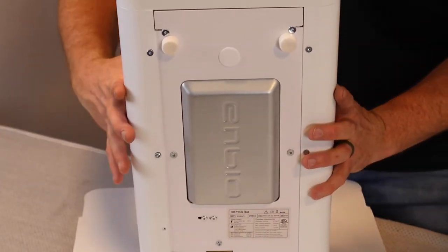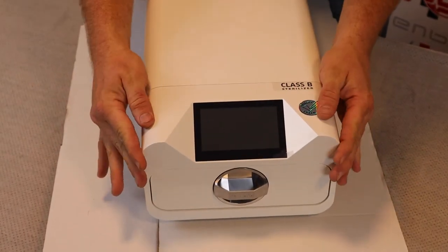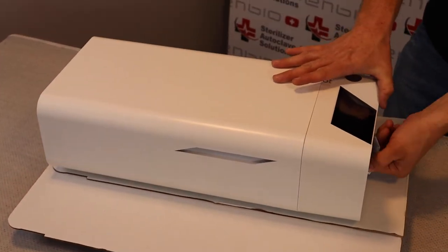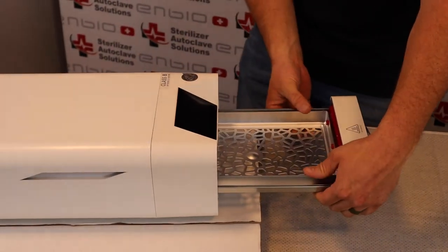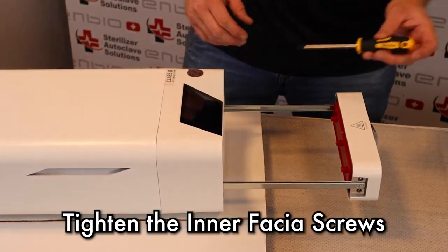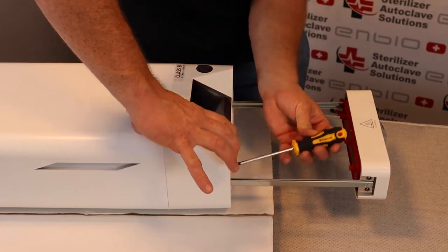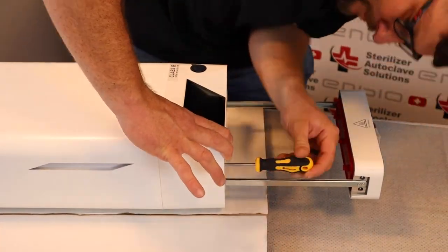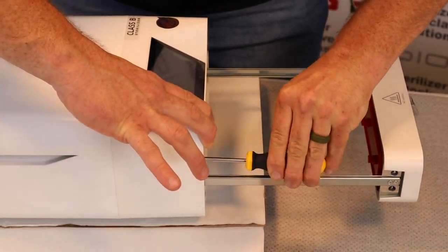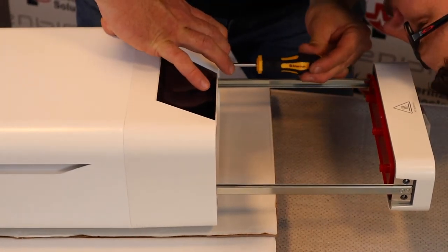Once that is complete, this fascia is still loose, so we're going to spin this back around and tighten down the top fascia screws. Starting with the top, we want to ensure there is no gap between the fascia and the back upper.